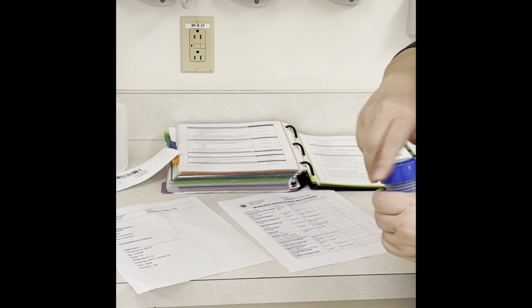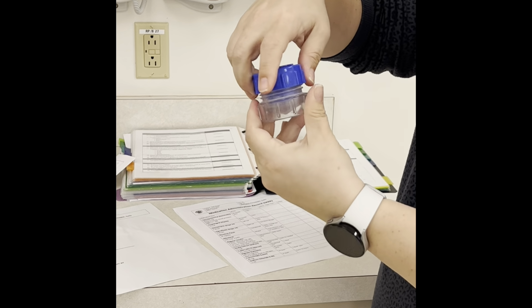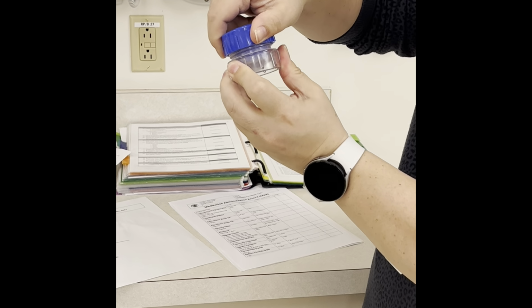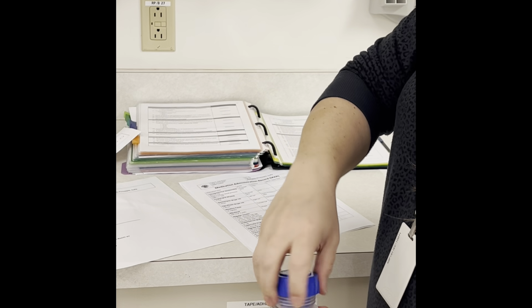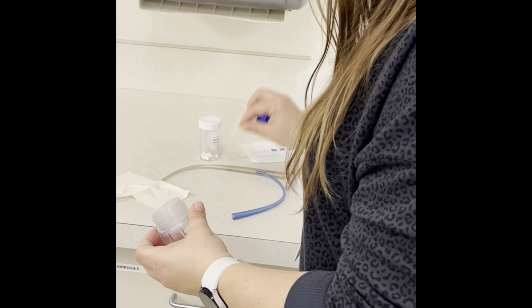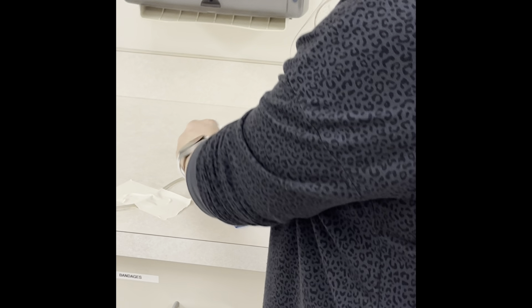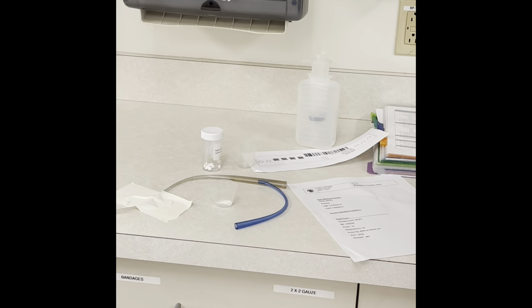We are going to twist it to crush the pill. I usually untwist a little again, shake it, twist it again so we make sure that the pill is completely crushed. And then you can look and see that it's a nice powder. We're gonna take that powder and we're gonna put it in a medicine cup. Just tap the side. And then it just tells you repeat the process for each medication.